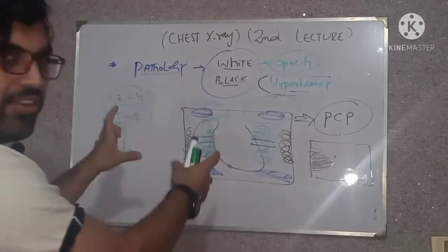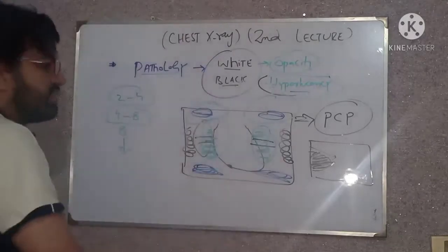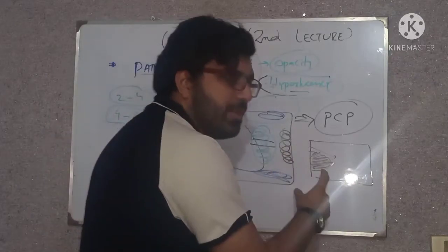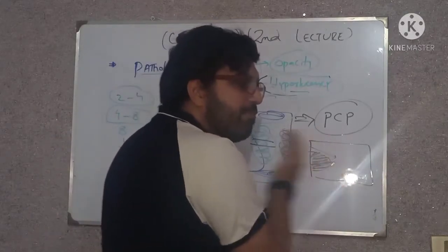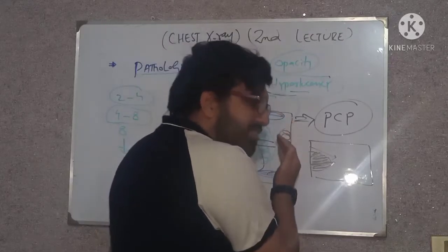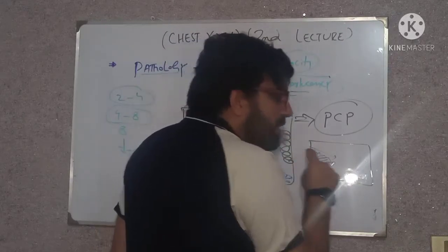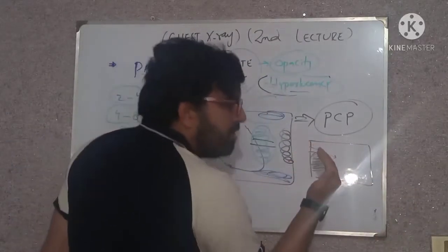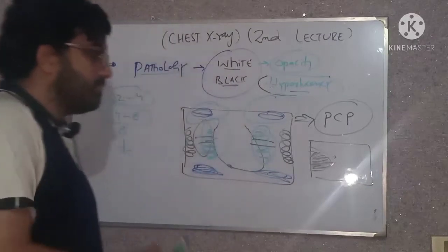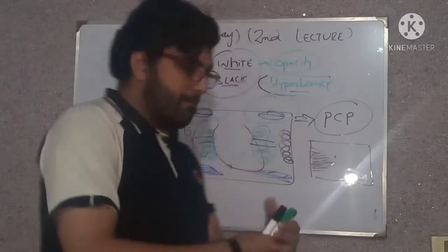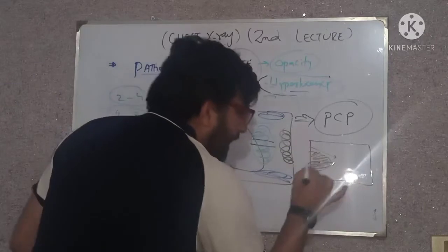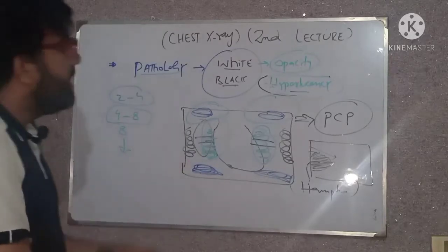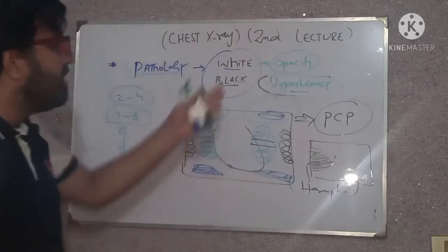Let's say the quality is satisfactory. Then you describe: 'There is a pleural-based opacity on the right side extending from periphery toward the mid zone, sparing the lower zone, the central zone, and the upper zone — forming a wedge shape. Most probably this is Hampton's hump, seen in pulmonary infarction.' Similarly, you can explain other opacities in the same way.